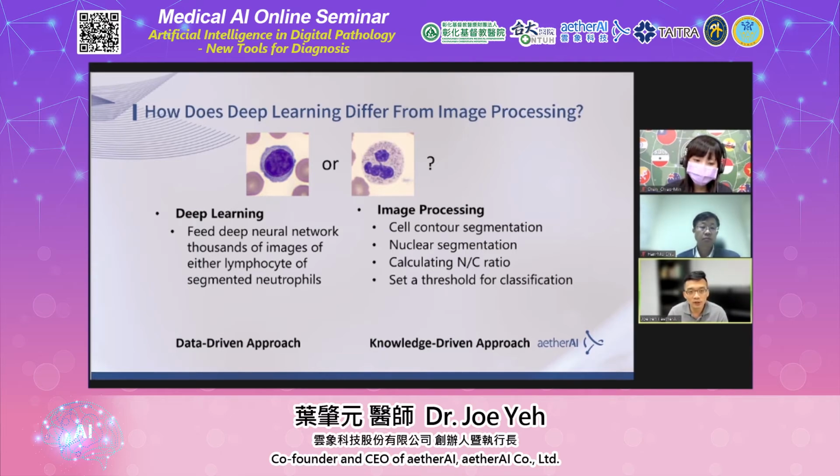Deep learning is operating in a very different manner. Instead of asking experts for their opinion, we only ask experts to perform annotation on the images.